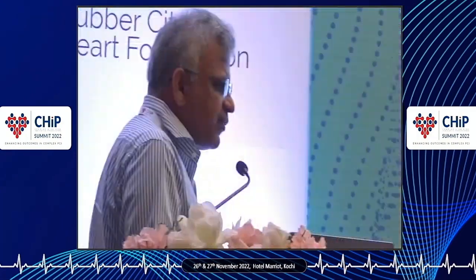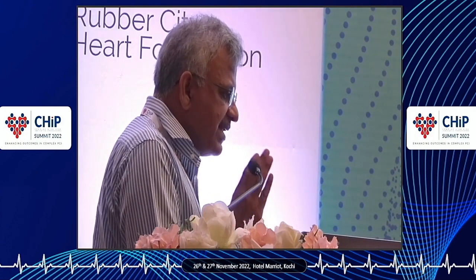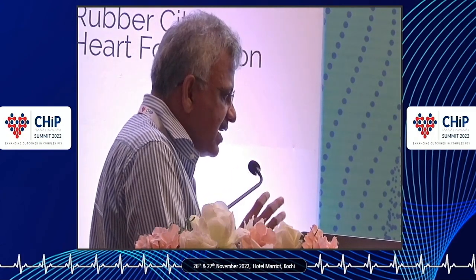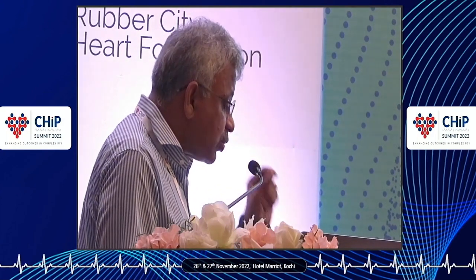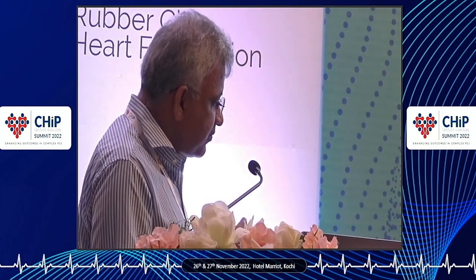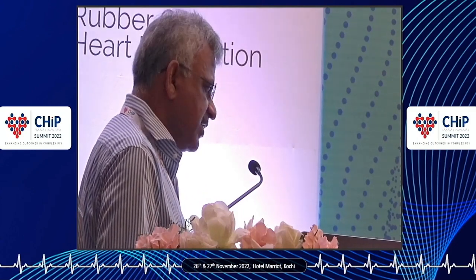I was using it for very safe lesions till I heard Antonio Colombo. He says if you have the most difficult lesion, the best thing to do is a BRS, because in case something goes wrong, the surgeon will still be able to tackle it. If you put a bare metal stent or a metallic stent throughout the LAD, you just kill the opportunity for the surgeon to do anything beyond that. So that really took me by surprise. And in calcified lesions, I deep-throat the guide or take a guide liner and make sure that the scaffold is not pushed through a very calcified, very rough area. Take it to the point and deliver it. So far, my results have been, touch wood, very good.